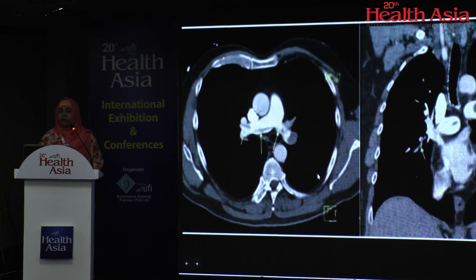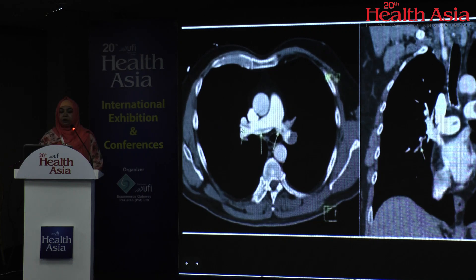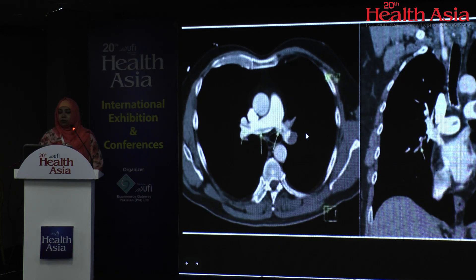Another example — this is a coronal view. You can see a large filling defect in the left main pulmonary artery and a saddle-shaped thrombus on the right side. This saddle-shaped thrombus needs to be critically and urgently communicated.